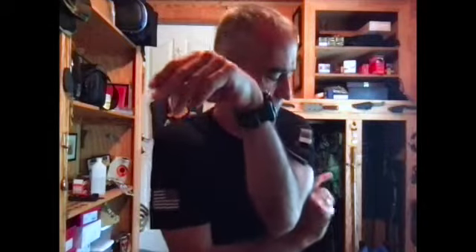The typical CAT tourniquet, great. This costs about $30 now. You can pre-set it up so that it can fit the largest part of your body, meaning your thigh. And these ones you can practice putting on yourself. And you want to cinch it down super hard. Turn the windlass until it's super uncomfortable.